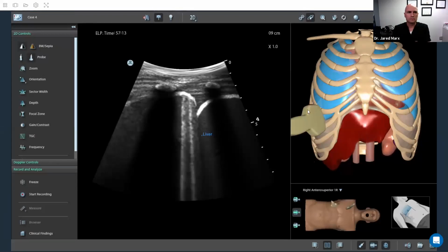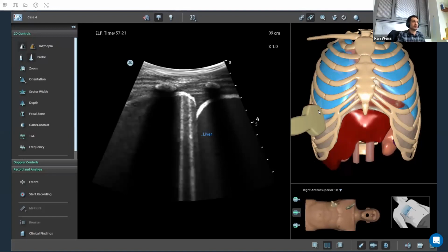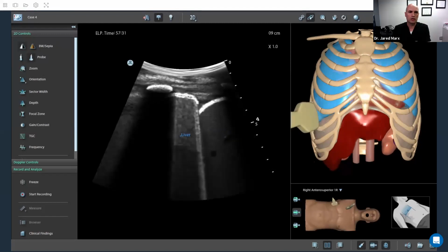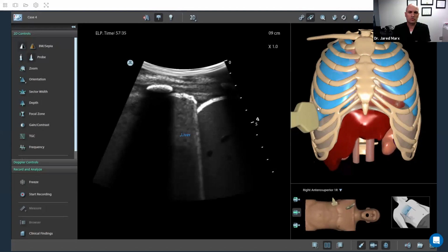Mhm. And so what is the diagnosis of this patient, for example? What do you do when this kind of patient comes to you? Yeah, so that's the hard thing: none of these findings in lung ultrasound are specific to COVID. These can all be progression of disease and many things. So a lot of infections will look the same as what we're seeing here. Obviously, the worse they are, the worse the disease is.